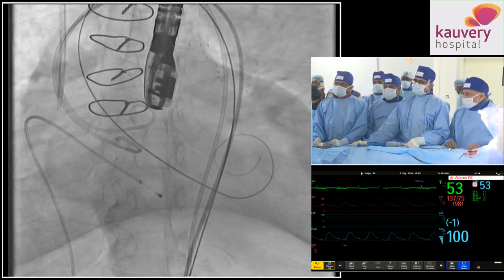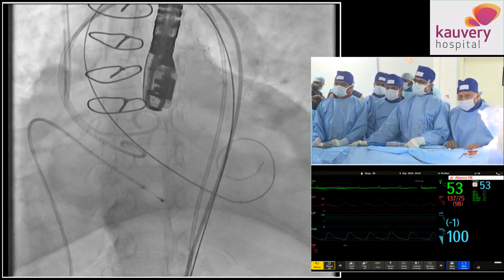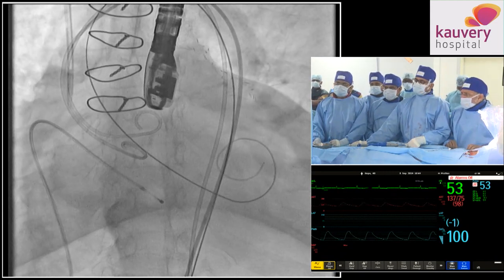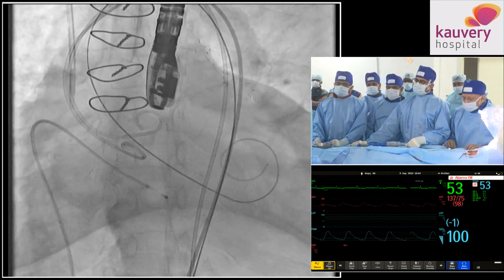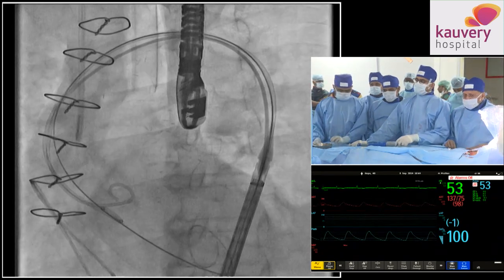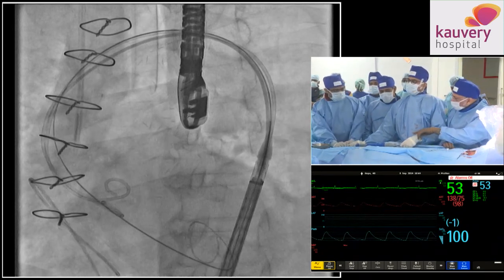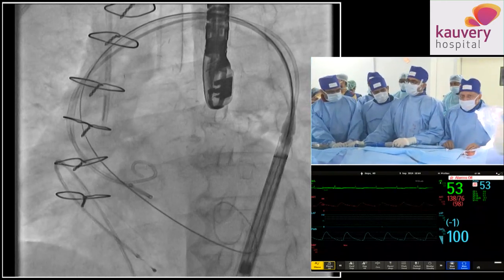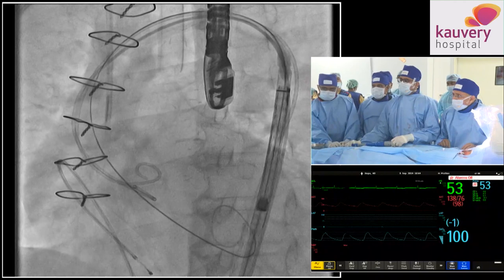137/75 after dilatation, so there is no significant AR, and on TEE also we don't see too much of AR after the balloon dilatation. So now we are ready with the 23 size valve, and this is a Medtronic Evolut R, and we are going to go ahead as per plan. So now can we have the fluoro?